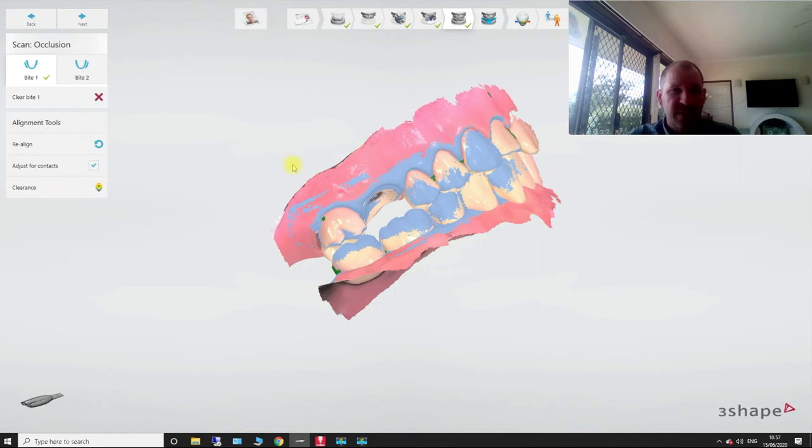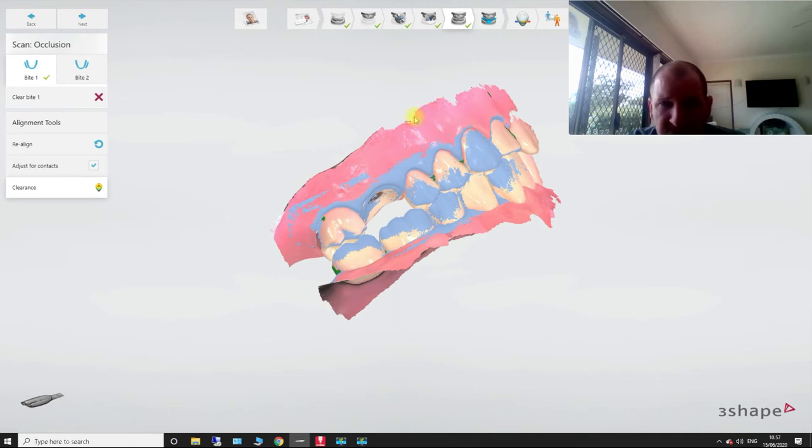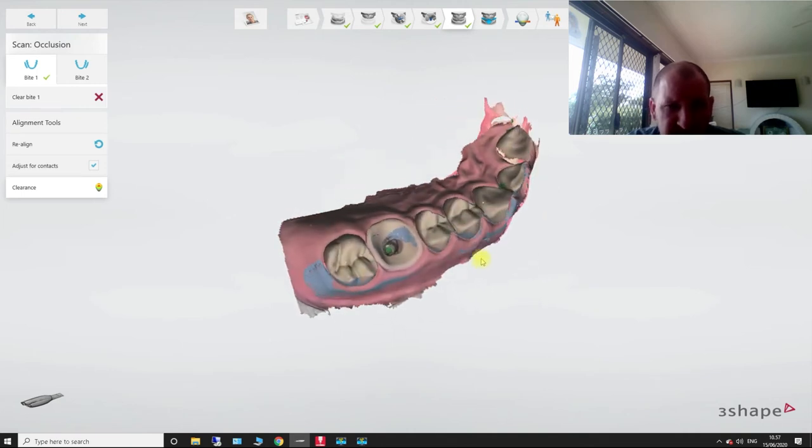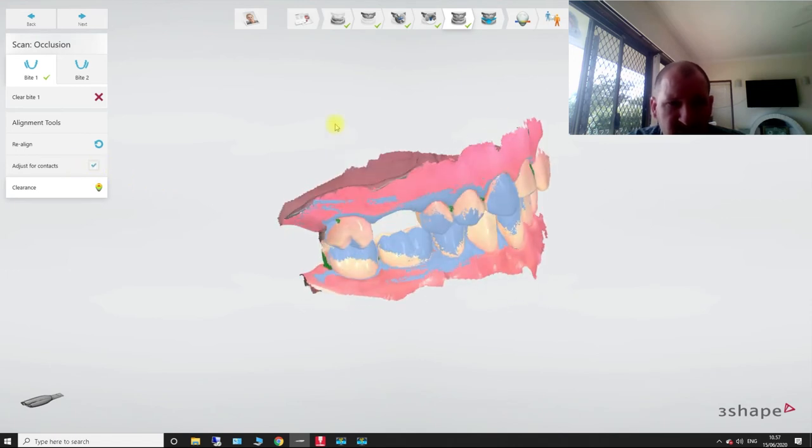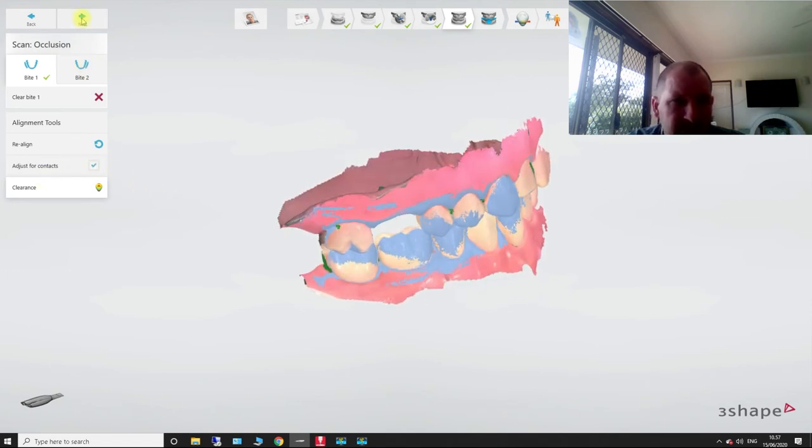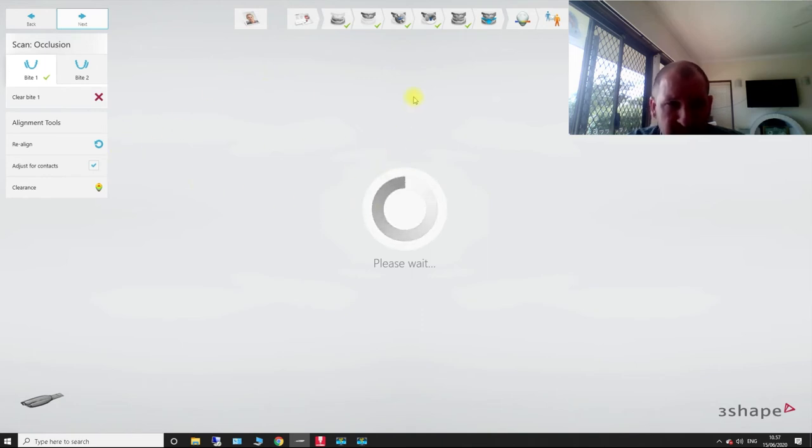Clearance. I'm going to check my clearance, make sure that I've got good heavy contacts because I want to make sure that I've got load on this bite before I send it off to the lab. So if you were to, let's just go next. We're going to post-process.